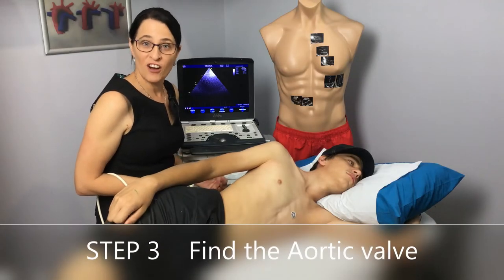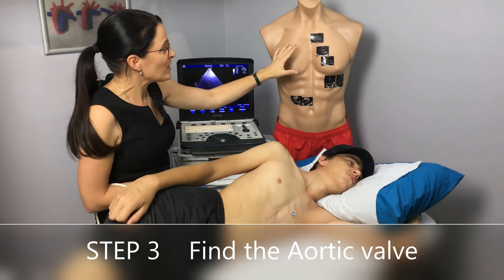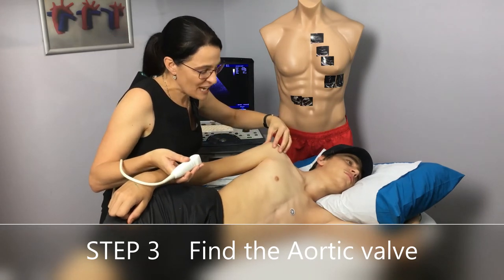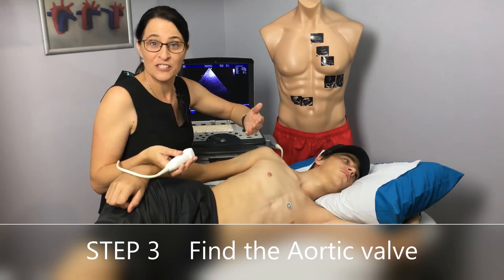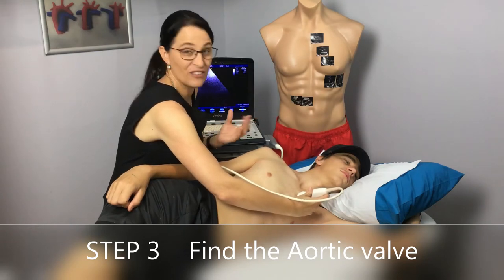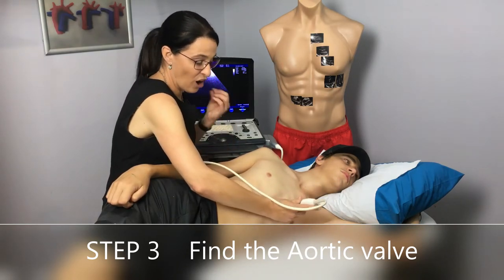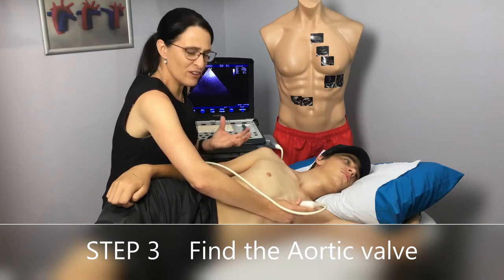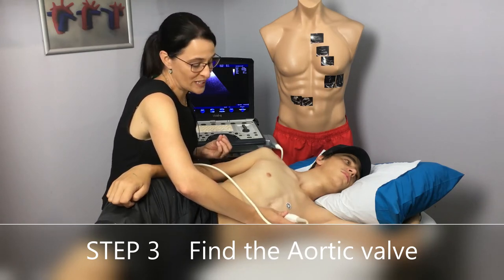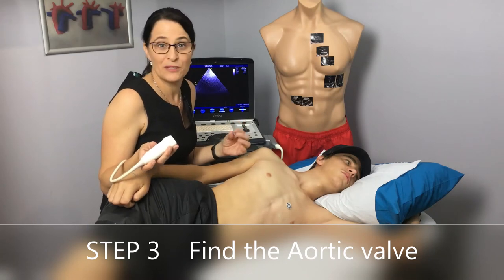Step number three: find the aortic valve. As you can see from each of the three parasternal windows, they all have a common element — the aortic valve. I've tattooed on my patient where the aortic valve lives. If you're attempting a high parasternal window and want to bring the aortic valve into view, you need to tilt down or tilt inferiorly. At the ideal parasternal window you may not need to tilt much at all, and at a lower window you'll need to tilt up.